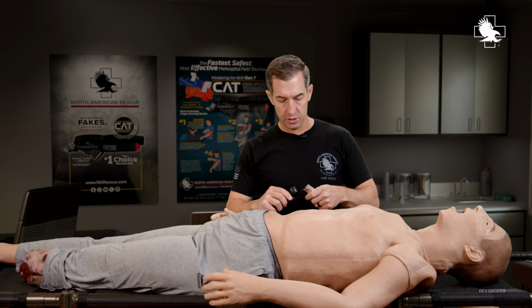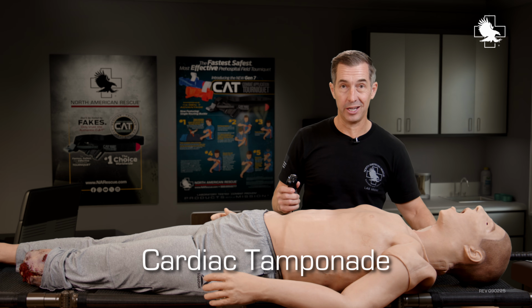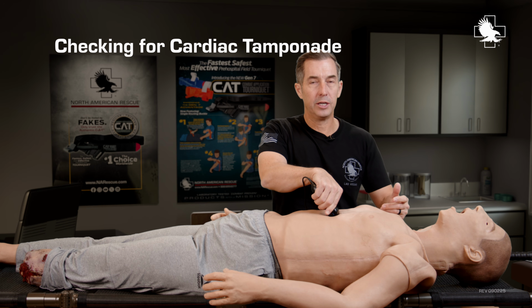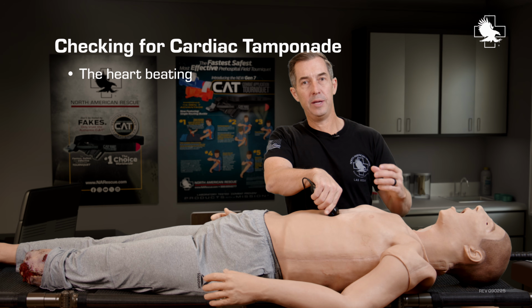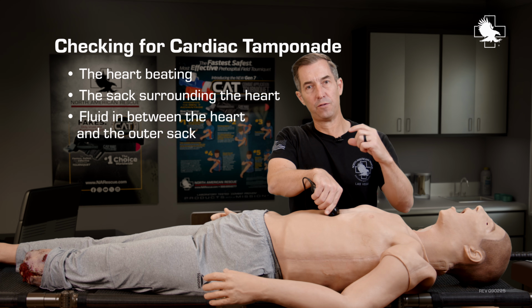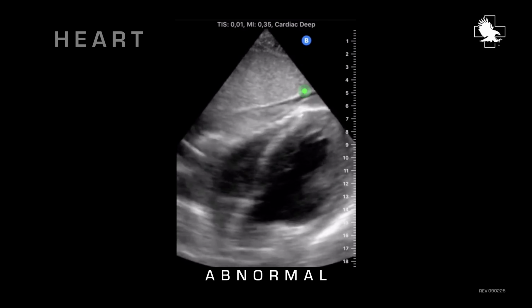So next up on our FAST exam, we're going to take a look for cardiac tamponade, and we can also get a nice view of cardiac activity. For cardiac tamponade, what I'm looking at is the heart beating. I'm looking for the sac surrounding the heart, and whether there's fluid in between those two. Typically, there shouldn't be any fluid between those two, but in cardiac tamponade, blood will go into that cavity and build up, restricting the heart and reducing cardiac output.